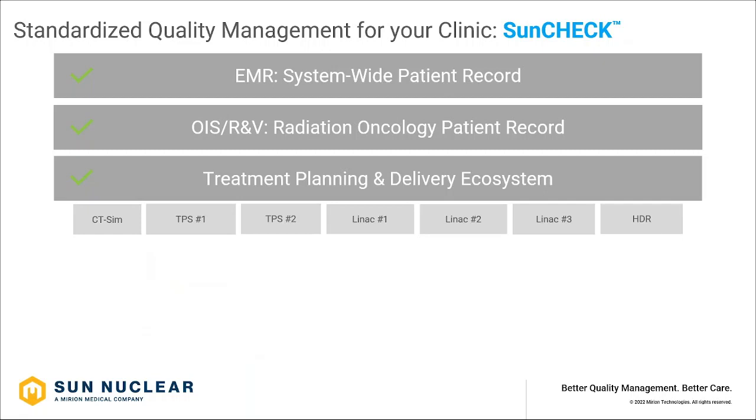So let me start off by giving you a larger overview of what SunCheck is all about. As most of you are aware, most hospitals have what we call an electronic medical record system to manage all their patient medical records.